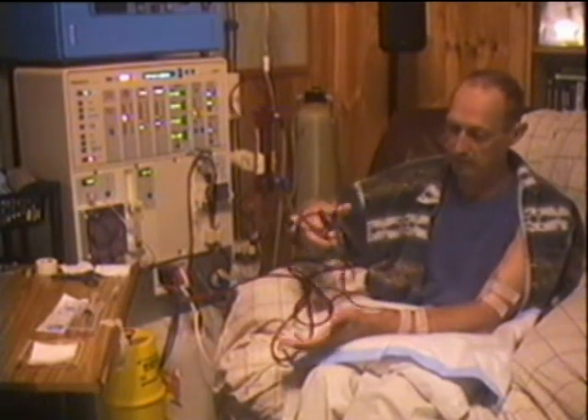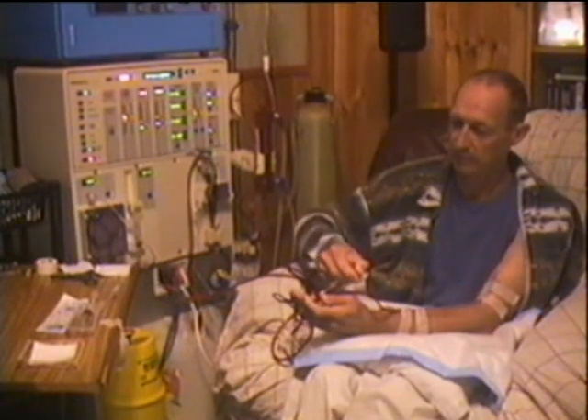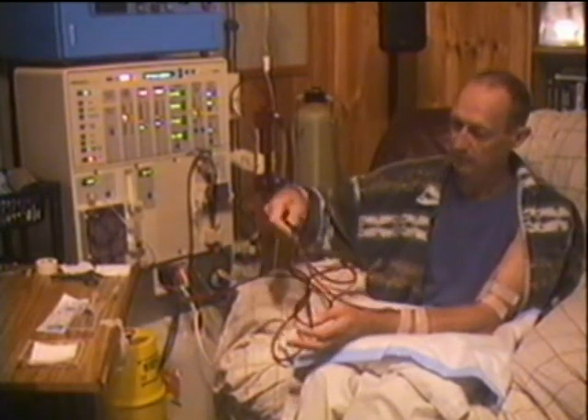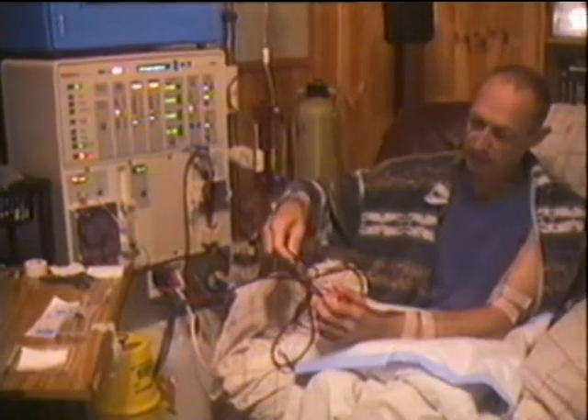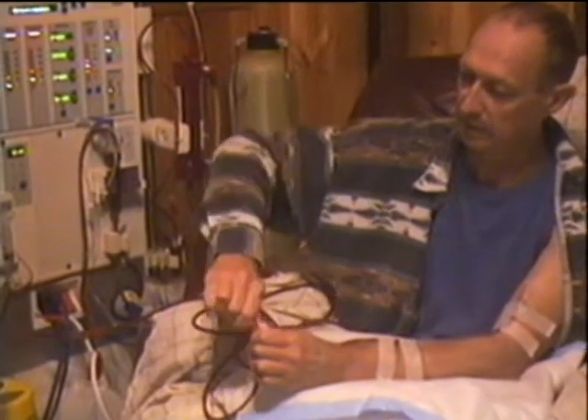So I will clamp the arterial line, clamp both ends — so it's clamped on the machine side and on the cannula. Now I can disconnect it so the blood doesn't go everywhere.